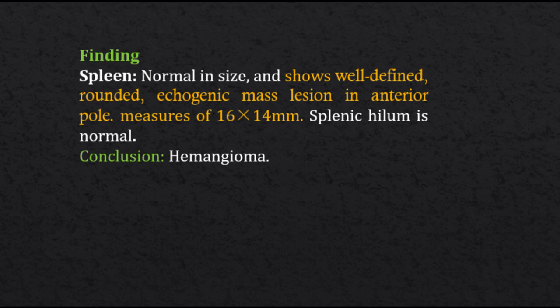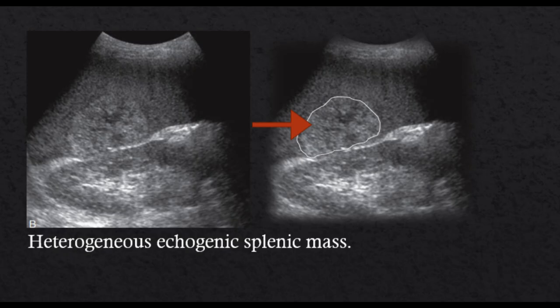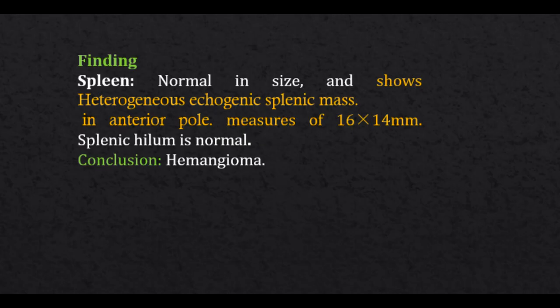Splenic hilum is normal. Conclusion: hemangioma. Second case finding: spleen normal in size and shows a heterogeneous echogenic splenic mass in the anterior pole, measuring 16 by 14 mm. Splenic hilum is normal. Conclusion: hemangioma.